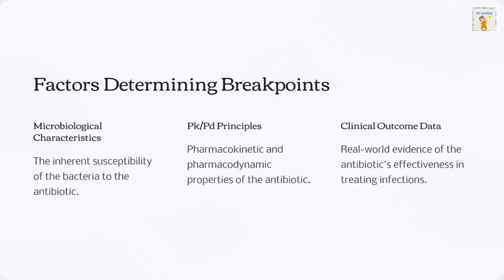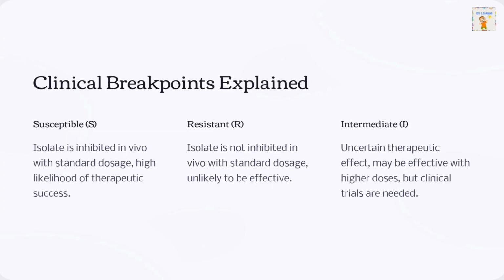What factors determine the breakpoint? Inherent susceptibility to the antibiotic, of course, the pharmacokinetic and pharmacodynamic principles, clinical outcome data and real-world evidence.